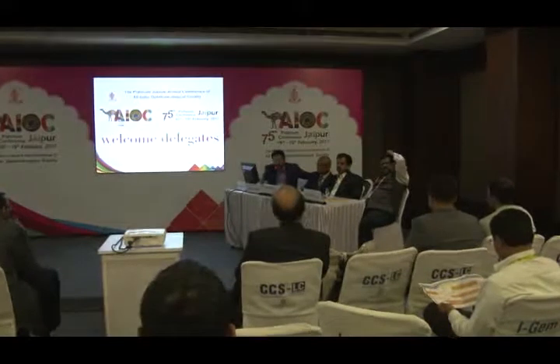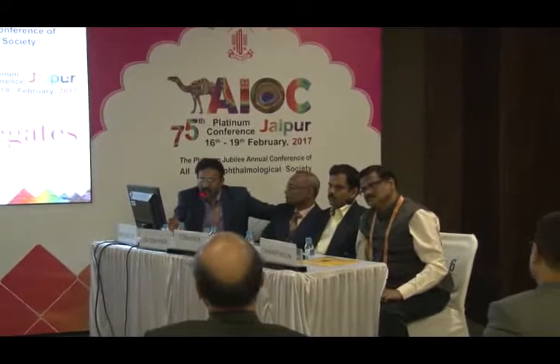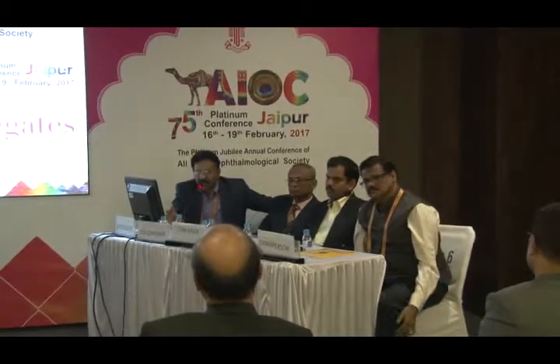So I think maybe in the next session I'll cover the design aspect. Buying the equipment is an investment in your practice. See, almost 70% of your income is going to depend on your operation theatre. You are willing to spend 50 or 60 lakhs on a phaco machine, but you don't want to invest 3 lakhs in a horizontal autoclave. So you need to change your mindset rather than going for cheaper. Please understand, whatever cheaper machines you buy, you are going to have a recurring cost. So it's better to invest in quality equipment right from the beginning rather than incurring recurring expenditure.